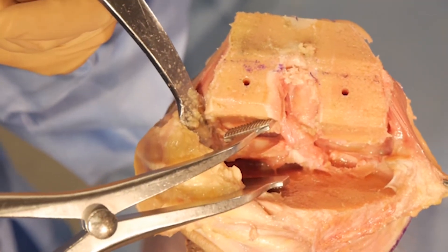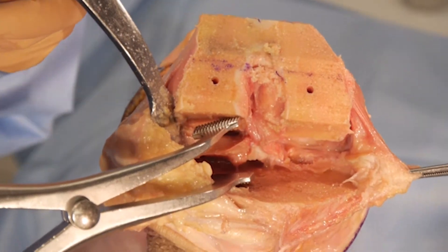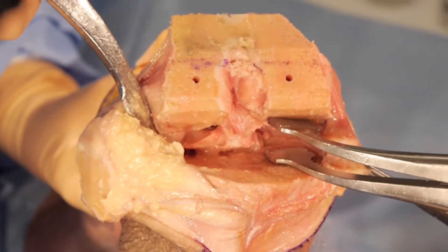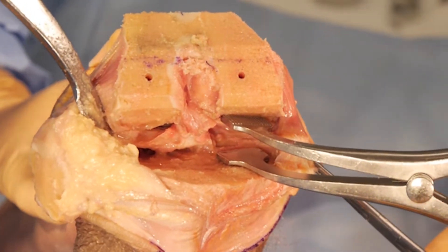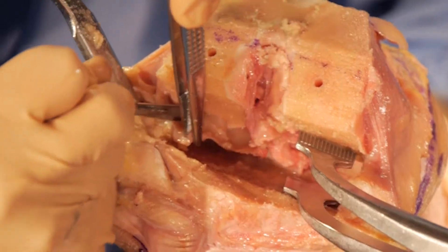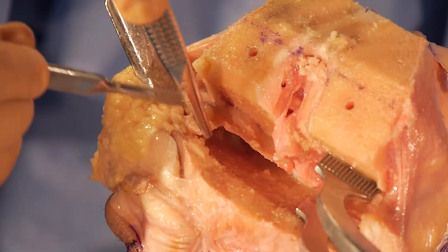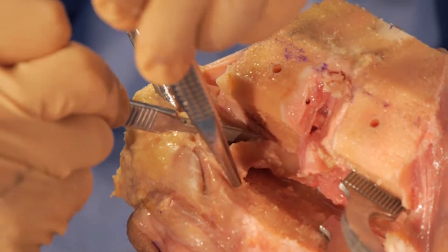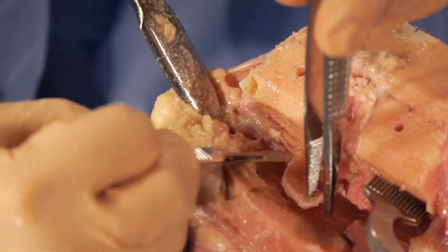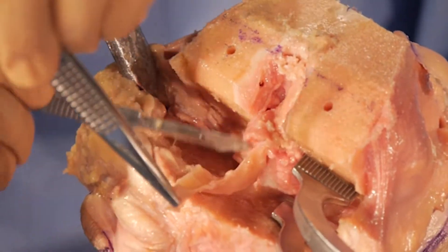Now I'll check to see if there are any posterior osteophytes in the back of the knee. In this particular case there aren't many osteophytes — she didn't have much arthritis. Moving to the lateral side, with the laminar spreader I get the same view. For this case I'm able to pick up my meniscus. There's a hiatus between the lateral meniscus and the popliteus, called the popliteal hiatus, which allows you to protect your popliteus as you come around the back of the knee. You can remove the entire lateral meniscus through this interval.